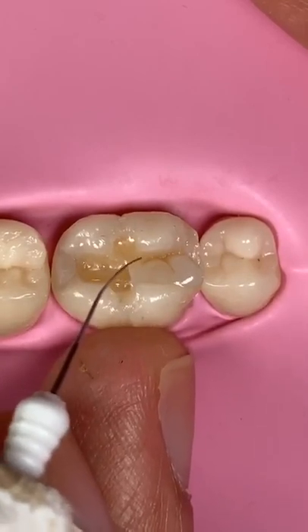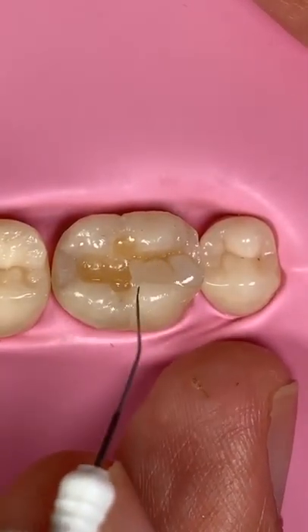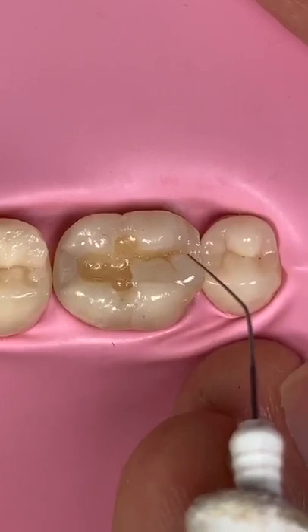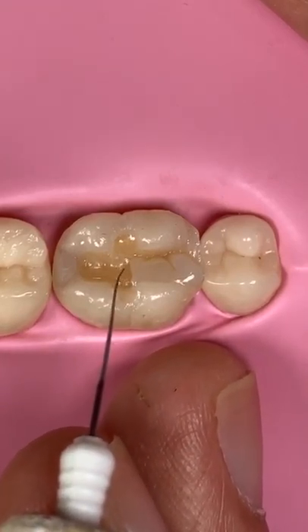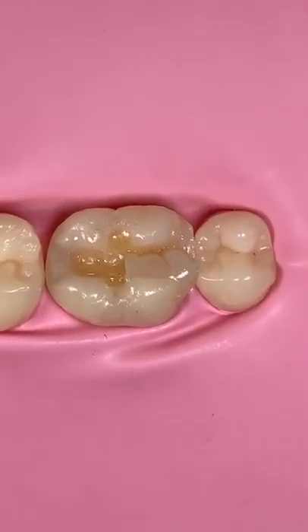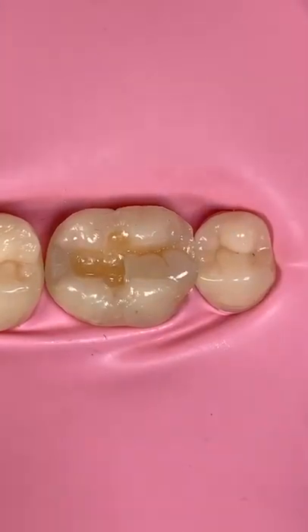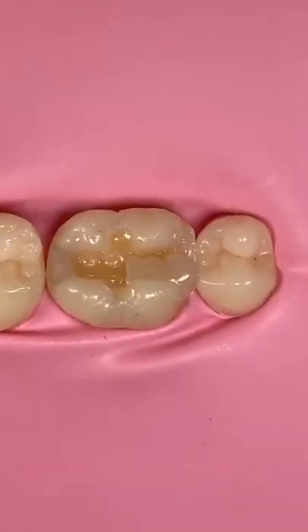Okay, don't forget to make it a little bit curvy, not too stiff. I can spend a whole night to recreate, yeah, because I really like carving. I really enjoy doing this. Okay, take your magic. If you have a microscope, we'll see better, or magnification.